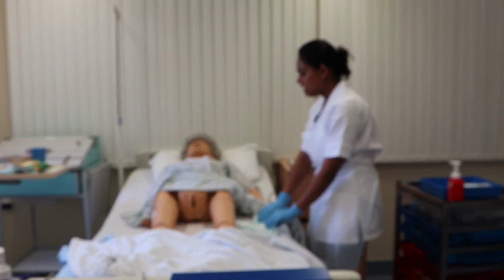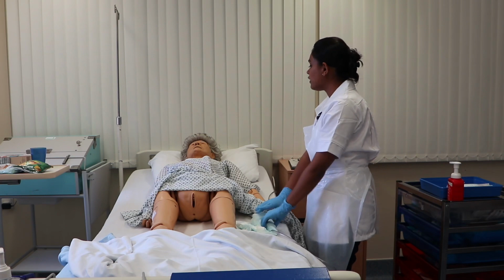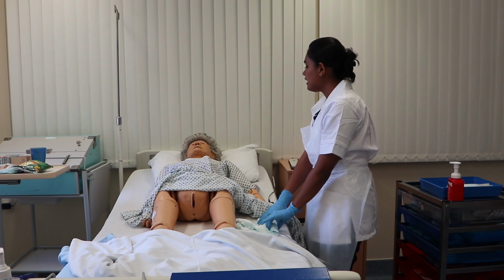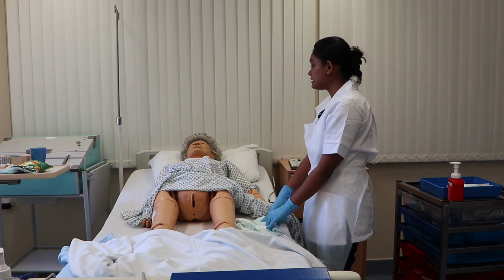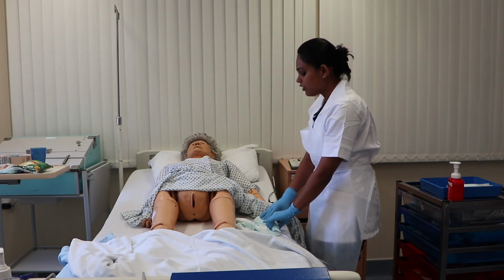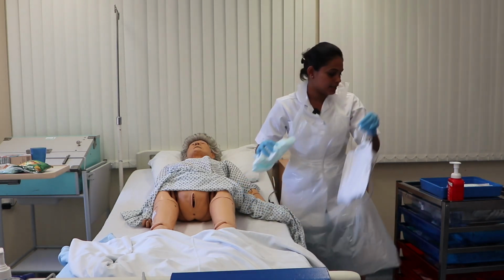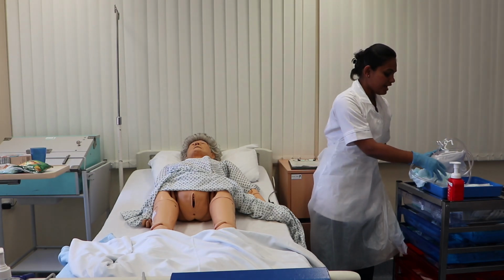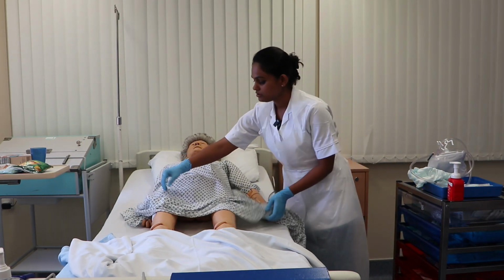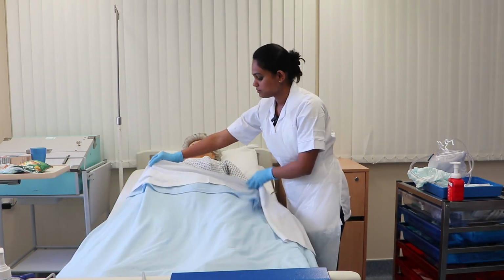Yeah. Okay, you need to take more water, and that is you need to take 2 to 2.5 liters of water every day, and you need to continue with your perineal care, and when you first void you have to inform me. Is that okay for you? Yeah. Okay, now I am going to remove the urine bag. This will go to the clinical waste bin later. Okay, and rolling down the gown and roll up the blanket.